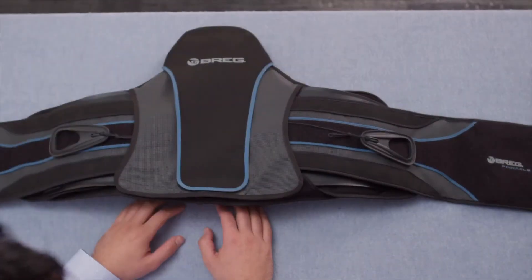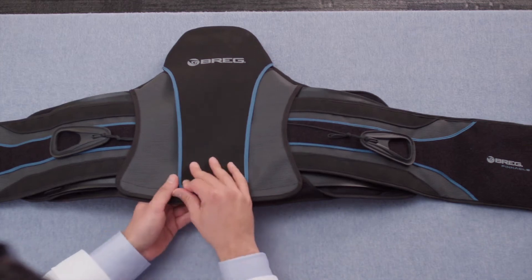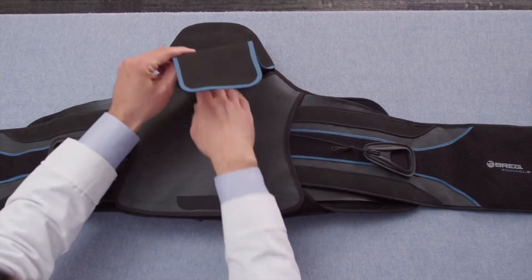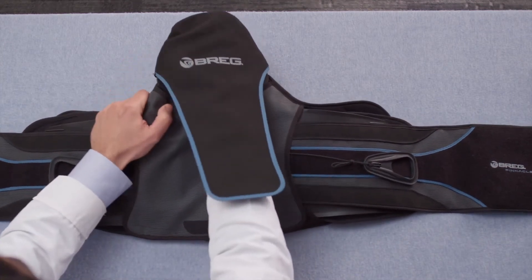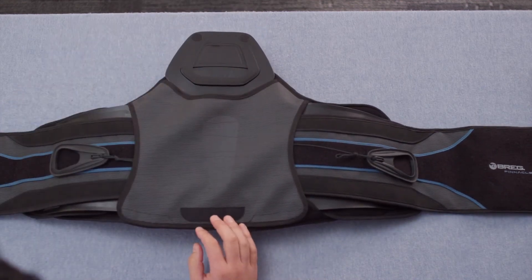We'll replace the pads on a Pinnacle 637 model, but the process is the same on all of the Pinnacle lumbar products. Start by removing the hood on the back of the Pinnacle lumbar product. This hood can be discarded if you're replacing it on a 631 or 637 model. However, on the 627 model, you're going to reuse the same hood.